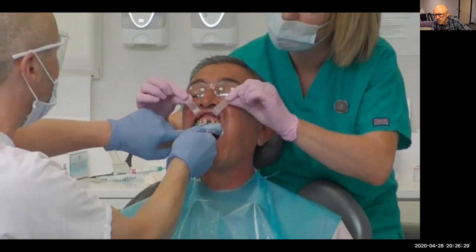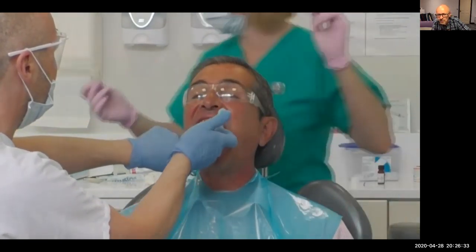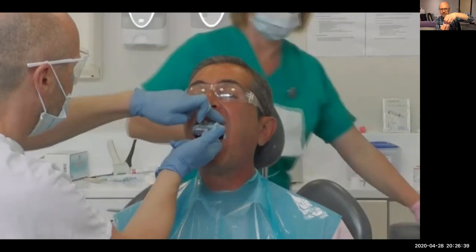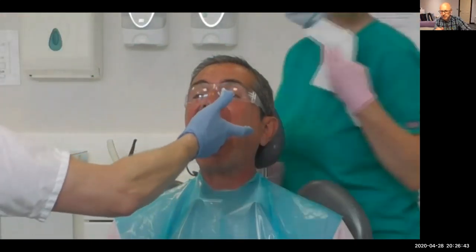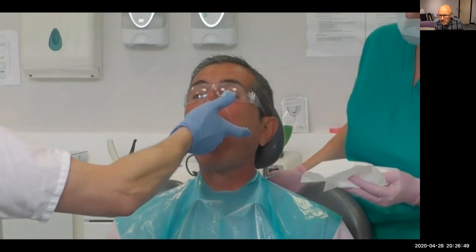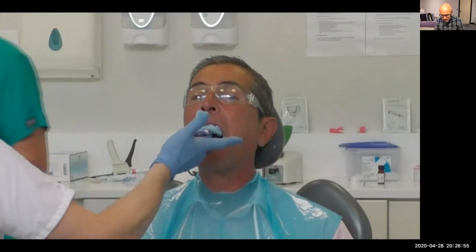Breathe through your nose, wiggle your toes, and push that tray up so that that red compound acts as a stop. And I'm also being very conscious about pushing the material away from the labial surfaces of the teeth there. I'm getting Joe to waggle his jaw as well here, just to give the coronoid a bit of space.